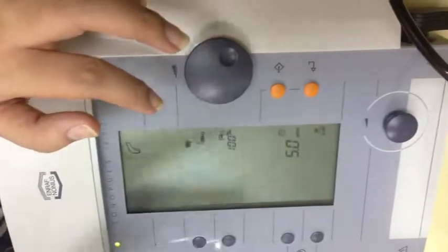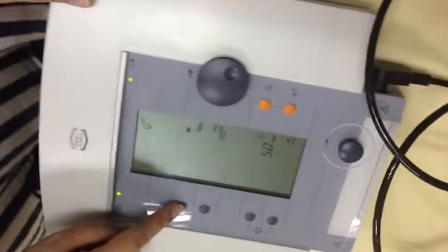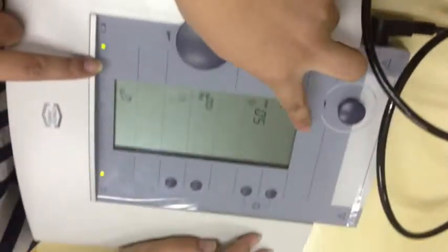Okay? So, paano tayo ngayon mag-start with this machine? Okay, sige. Sinong gustong mag-subject? Kanina pa ba nagbi-blink to? Hindi, nagbi-blink talaga siya on its own. So, pag pinress ko to, okay, magbi-blink siya, kasi magkaiba sila ng sound. Okay? So, wala na itong pipindutin para mag-blink.